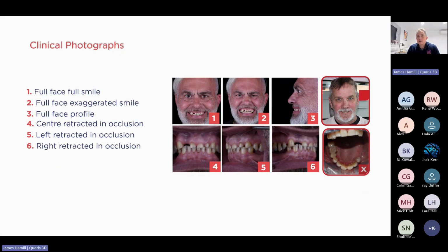It is really important you provide us with photographs if we're going to design, especially in 2 appointments, a full arch restoration. We cannot do it without photographs. And just having a close-up photograph is not enough. We must see the full face.